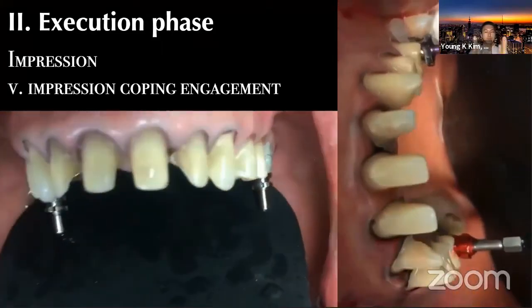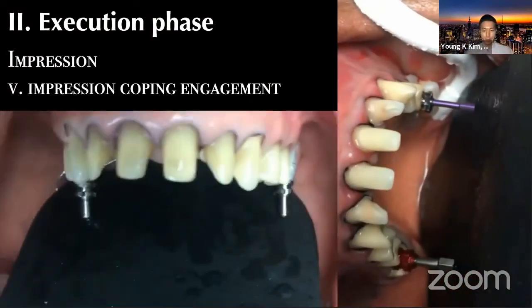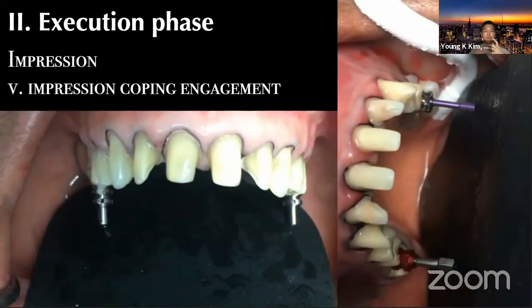And the digital impression has been amazing. However, in my humble opinion, it's not quite practical in full mouth reconstructive cases, especially with multiple subgingival margins in the anterior area. Inevitably, you need to put the cord, and there will be a time sensitivity when you're taking the impression.